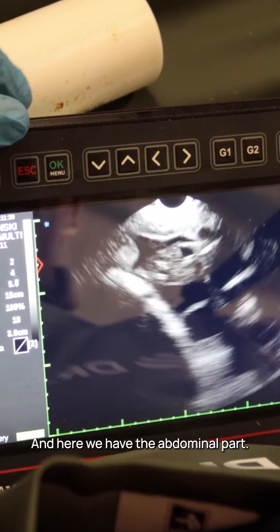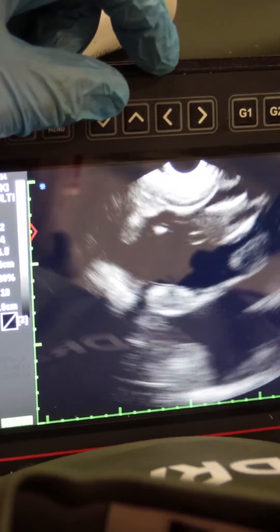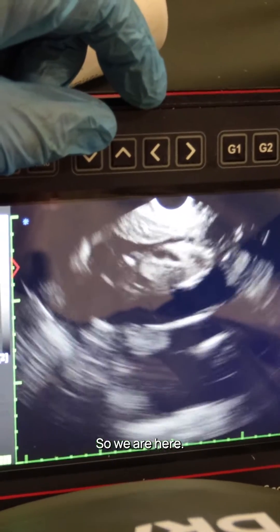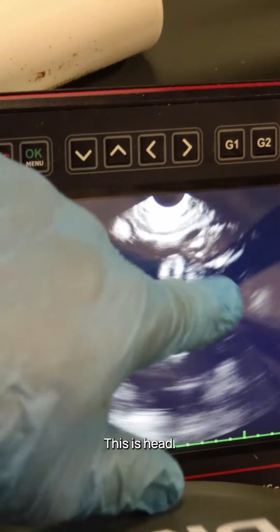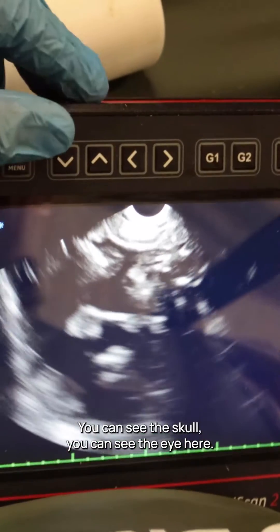Here we have the abdominal part, here we have a tail, and on our right side somewhere here is the head. This is the head — you can see the skull and you can see the eye here.